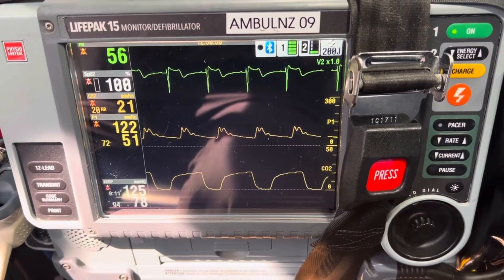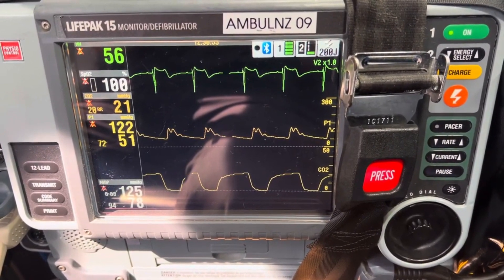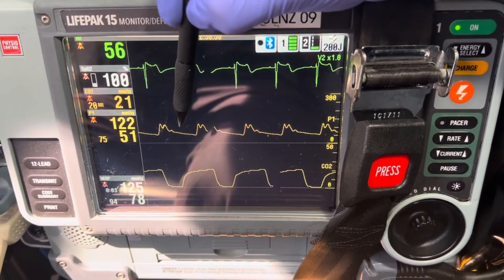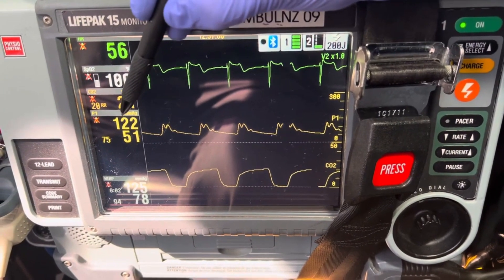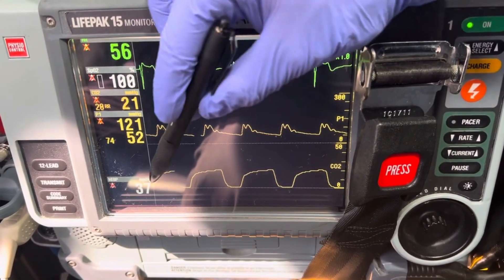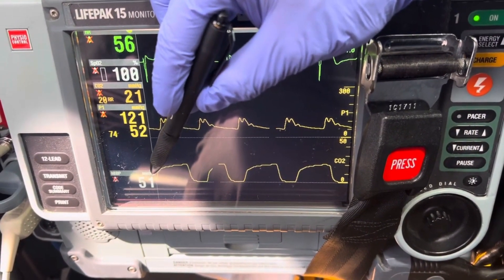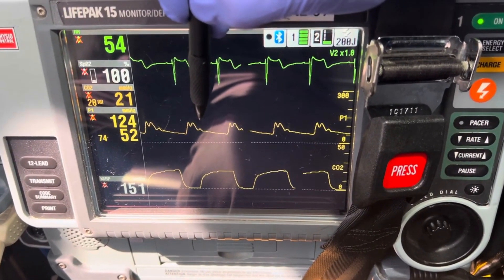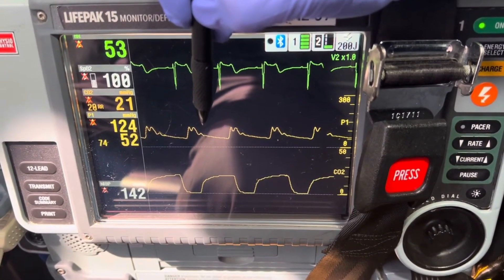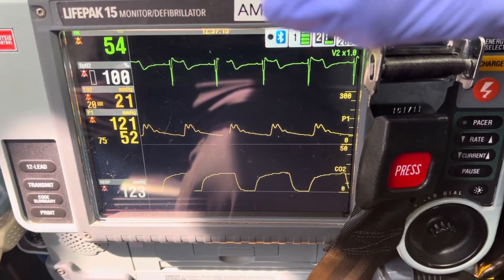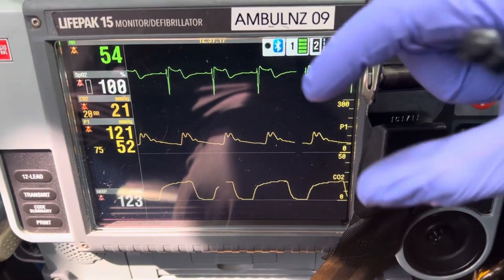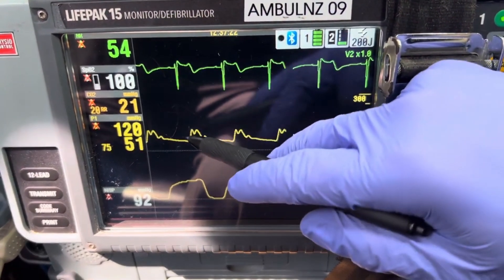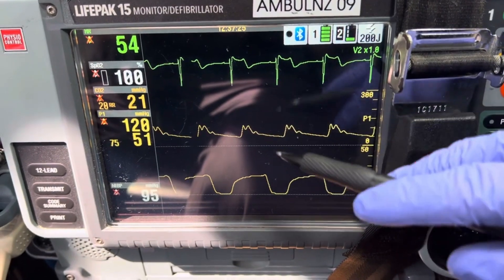This patient is on an arterial line — invasive monitoring. He has a radial A-line. You can see the dicrotic notch here. His BP is currently 122 over 51, with a MAP of 75, and we have the non-invasive cuff going as well. I'm going to show you how to do a fast flush test to confirm proper dampening. You find the pigtail or press buttons on the transducer, quickly flush it, and let go — flushing the A-line with saline. You should see oscillations, up and down. Two oscillations are good.